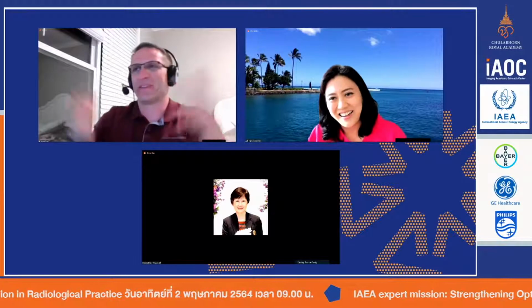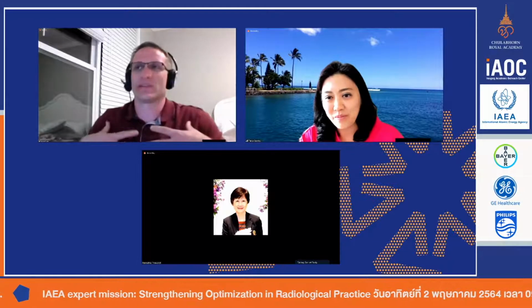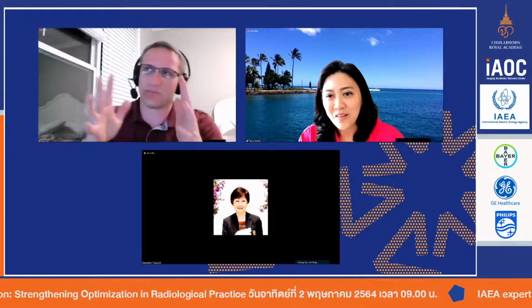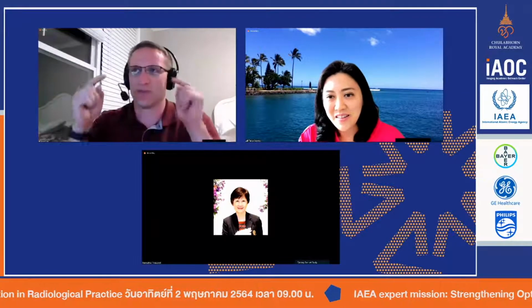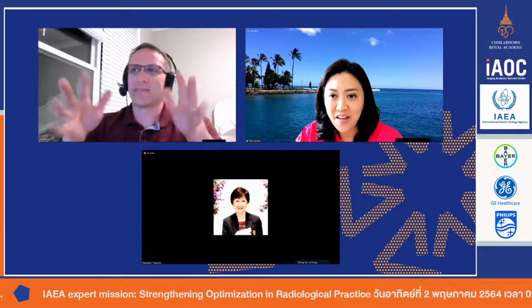That's a lot of people don't quite know why chest X-ray is a high kV, because it sounds opposite, right? Chest is lung, so you would think you wouldn't need as much radiation, but it's not that we're worried about that. We're trying to actually remove as much of the bony signal in the image, so that the radiologist can see through it to the lung anatomy. So chest X-ray should be the high kV and abdominal should be the low kV. I would say low to medium.